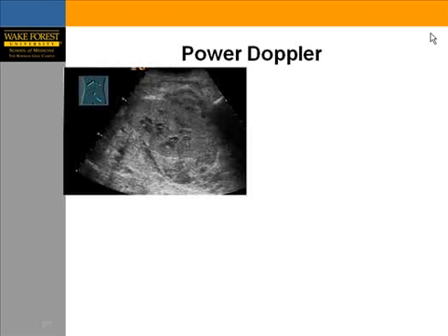Let's look at this example of this case. This patient had a kidney transplant. Earlier during the day had a kidney biopsy, and the clinicians want us to evaluate for left lower quadrant pain. As you can see the kidney nicely, but you cannot really appreciate what's exactly going on around this kidney. So there's a concern for hematoma in this instance.